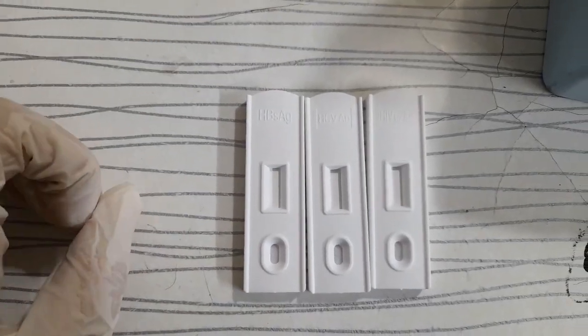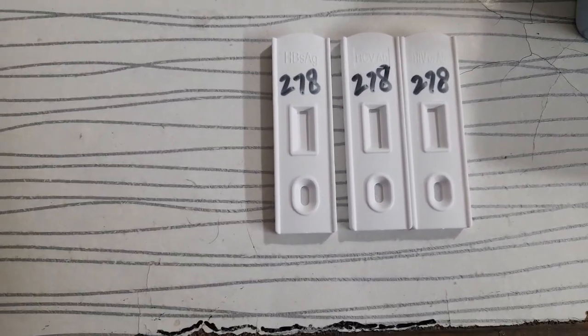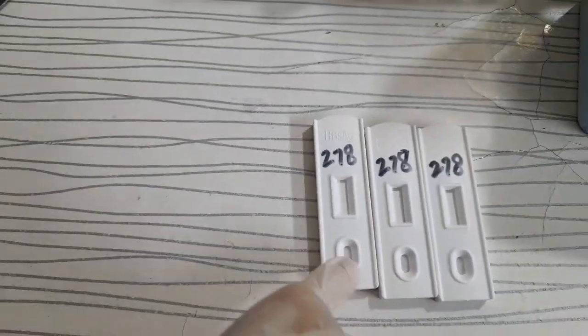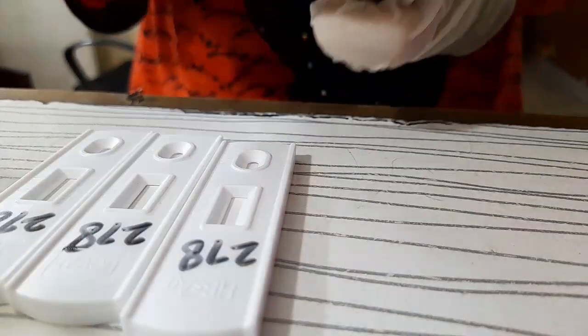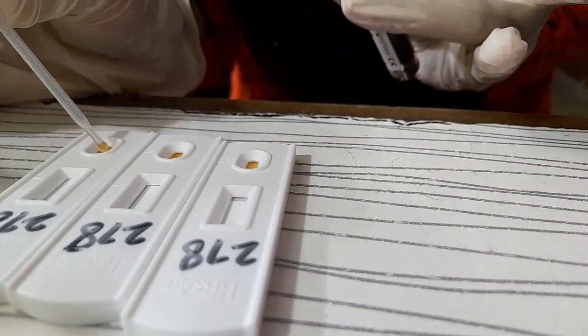The labeling is very important in the lab because every sample is unique. Now you have to take the samples in the sample place and wait until the control line is on the sample.